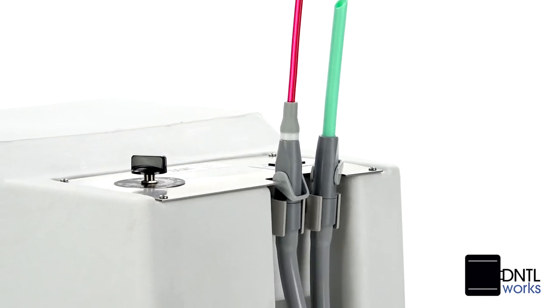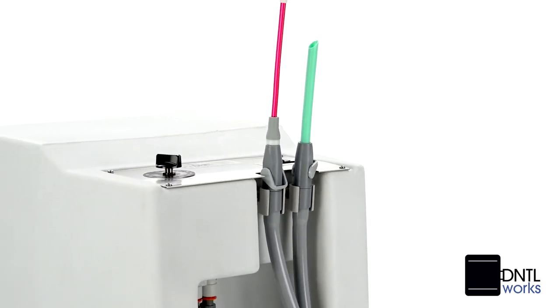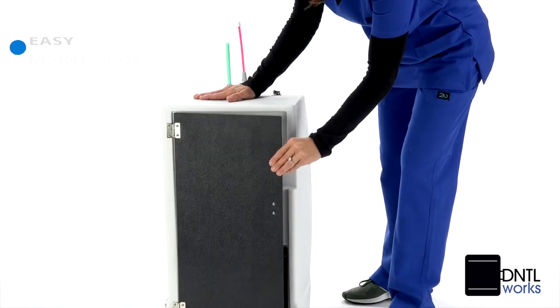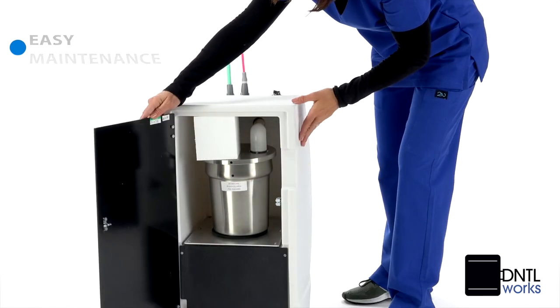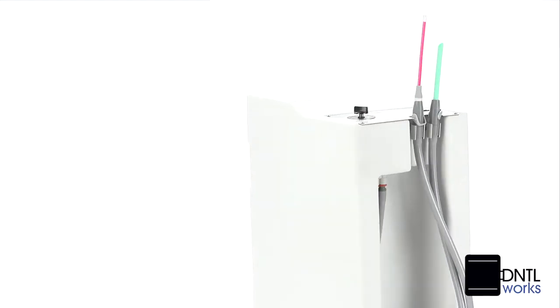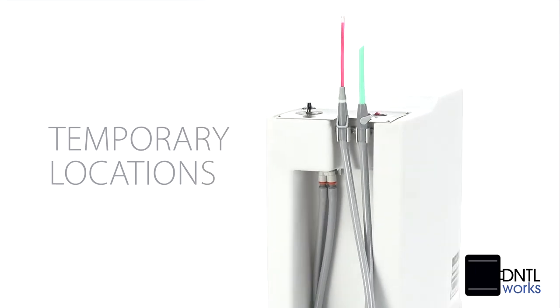That makes it an ideal backup for when the central system goes down and excellent for limited budgets. Maintenance is easy for the non-corrosive collection canister, and the vacuum moves easily on large carpet casters. Professionals find it ideal for temporary locations.